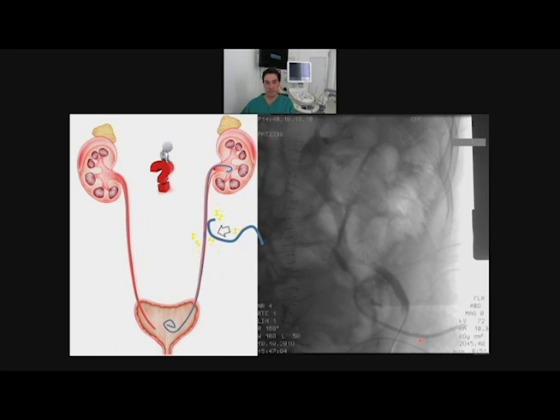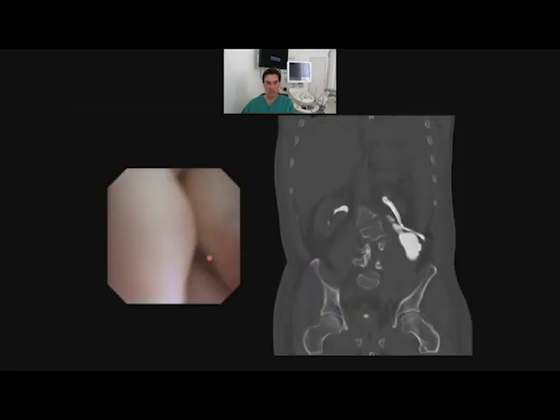First, the surgeon does a drainage. This is typically done, but it doesn't work, because the normal working of a stent is that only 10 to 20% brings the urine through the double J to the bladder, but 80% goes outside. That's why wound healing of the ureter, and stopping the urinoma, is not possible in most cases.